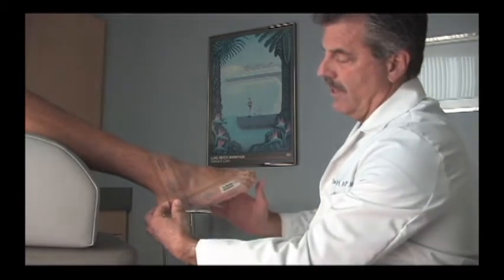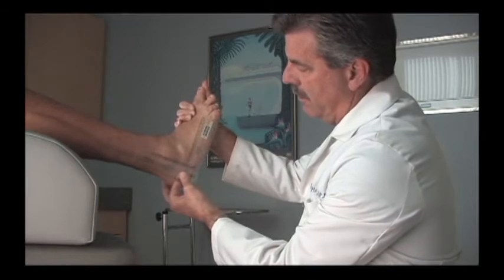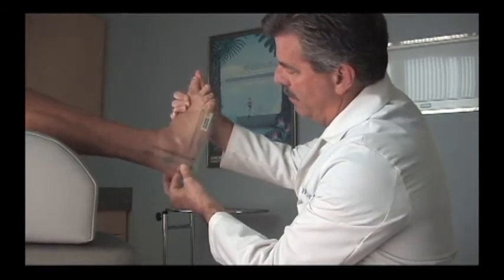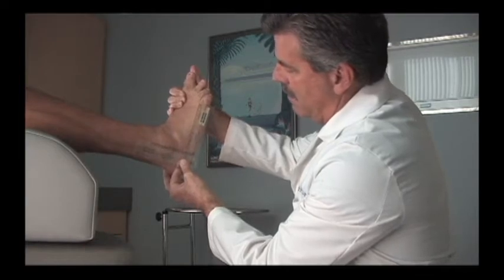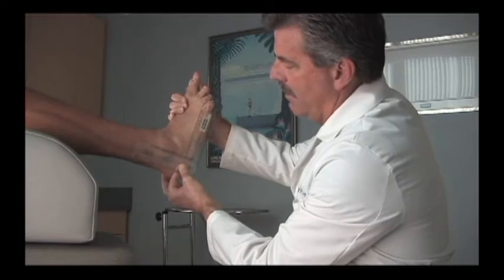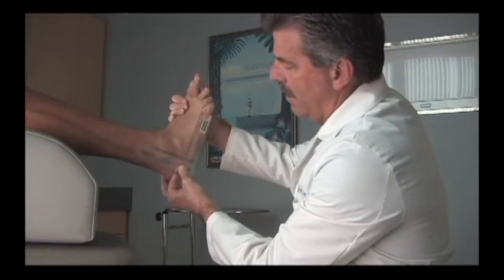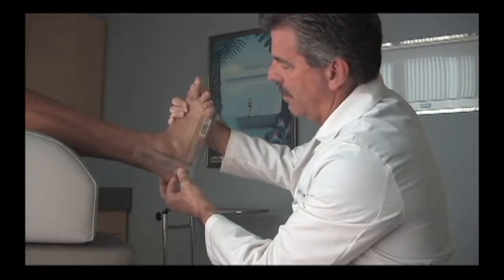With our goniometer set at 90 degrees, if we load this foot we can see that with a little bit of effort we can get the patient just to 90 degrees, and there is no spasticity. Therefore, if the patient can achieve 90 degrees, we classify them as not having equinus and they are a candidate for a hinged Dynamic Assist Brace to correct the drop foot deformity.